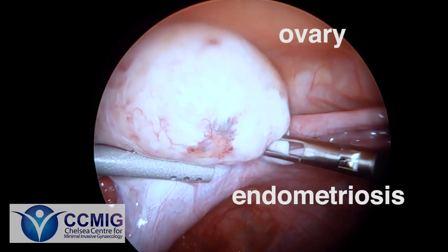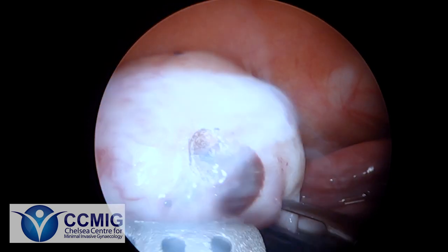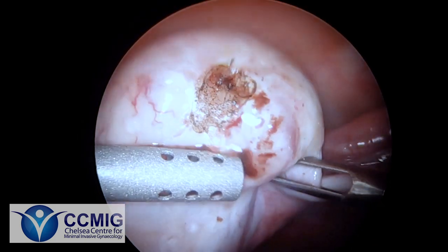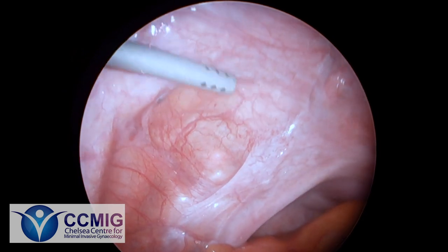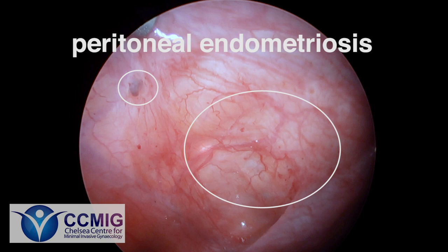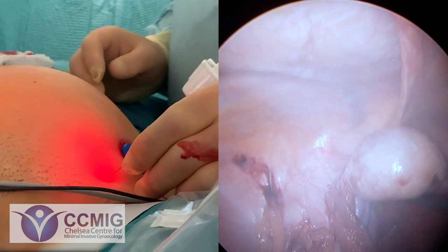Now we're going to excise this small spot of ovarian endometriosis. You can see that dark brown — we call it chocolatey-like fluid — coming out there when the laser excises this patch. That's all endometriotic tissue, the same sort of tissue we find in a large endometriosis cyst on the ovary, what we call an endometrioma. The device we're using to excise endometriosis in this case is a carbon dioxide laser. Here we get a closer look at this endometriosis on the left hand side, all living very superficially on the peritoneum, which we're going to excise in two seconds.